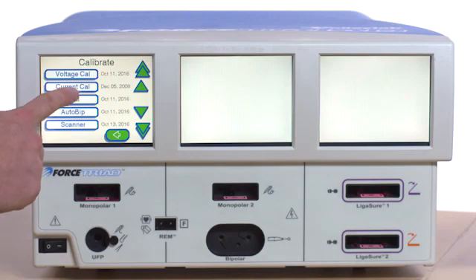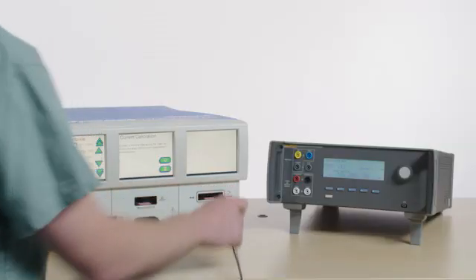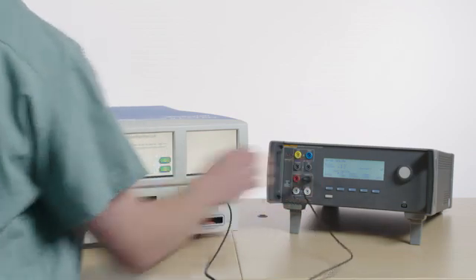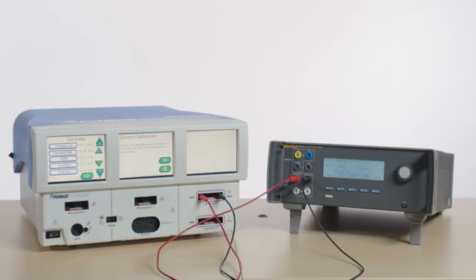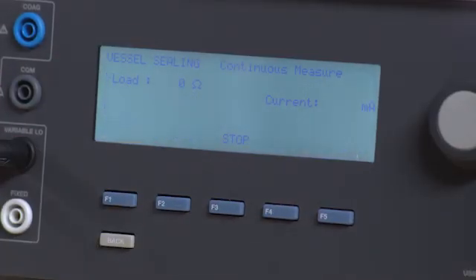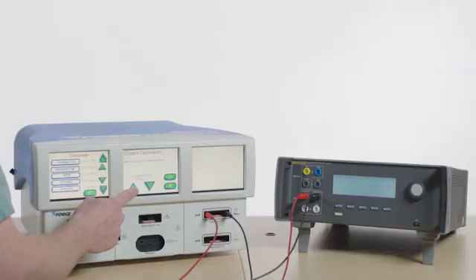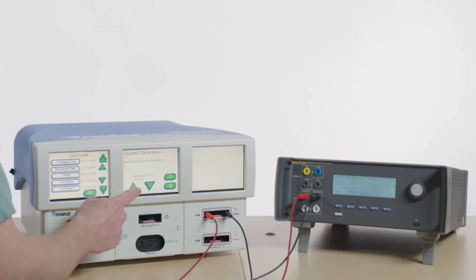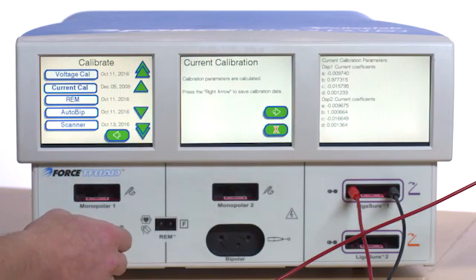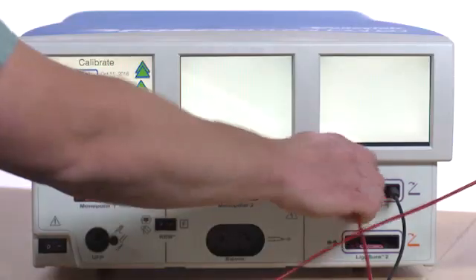Select Current Calibration from the Calibrate menu. Included with the QAES-3 are two special cables for ligature ports. Connect the black cable from the rightmost jack of the Force Triad Ligature 1 port to the variable low on the QAES-3. Connect the red cable from the leftmost jack of the Force Triad Ligature 1 port to the variable high on the QAES-3. Press F4 for start continuous. Follow the on-screen instructions on the Force Triad and select the right arrow button to continue. Whenever the QAES-3 times out, simply press F4 for start continuous. After the on-screen calibration instructions have been completed, select the red X to exit. Press F3 on the QAES-3 to stop the test. Disconnect all test leads.